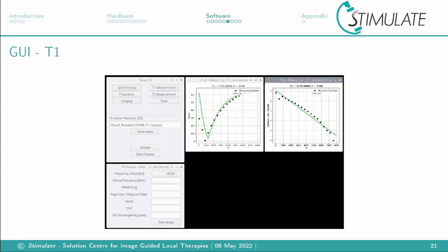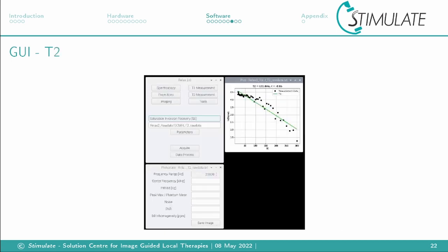This slide shows the T1 measurement. On the right-hand side, you see the linearization of the amplitudes over different inversion times and the linear regression to get the T1 time. The same goes for the T2 measurement, where the saturation inversion recovery sequence is used.